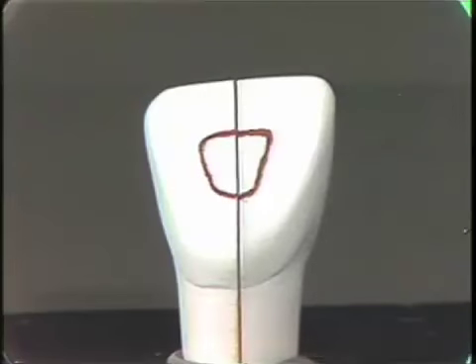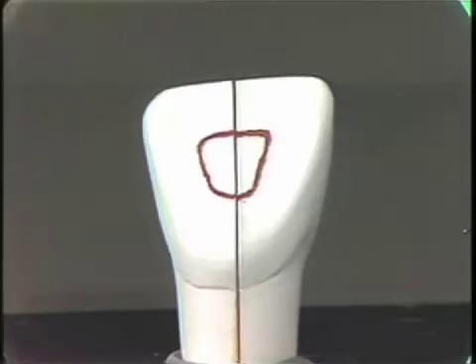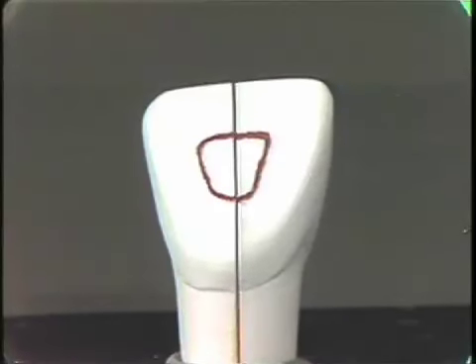I'm going now to go through a step-by-step presentation of the procedure for unroofing the pulp chamber. The first example that we're going to use is the maxillary central incisor. We'll go through that in great detail, and all the other examples we'll go through rather quickly since the procedure is very much the same.